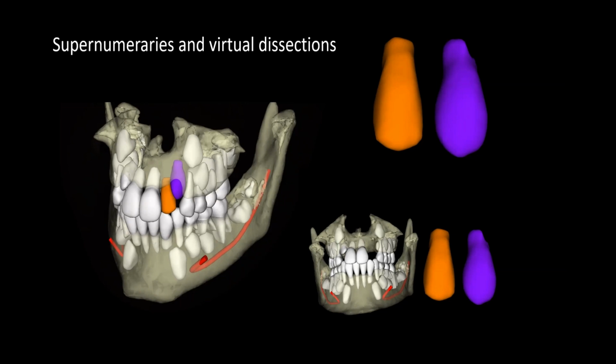So what we do is through the in vivo model, segment the teeth, we virtually move them, extract them, and analyze. And we can rotate and look at the morphology, because it's important to know which one is going to be extracted, which one are we going to keep.